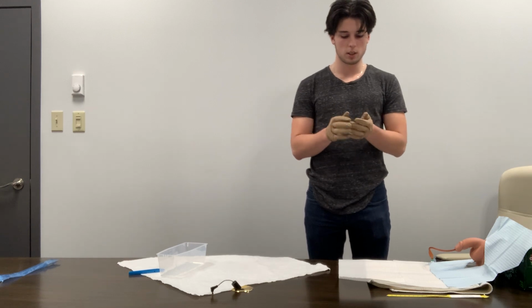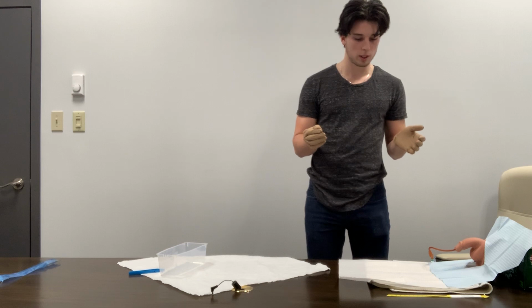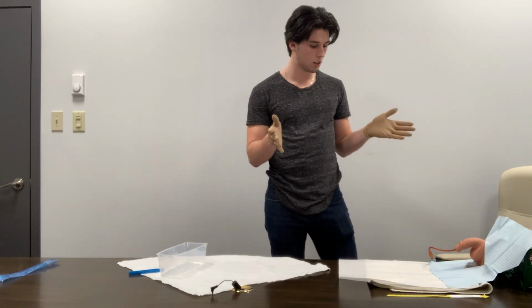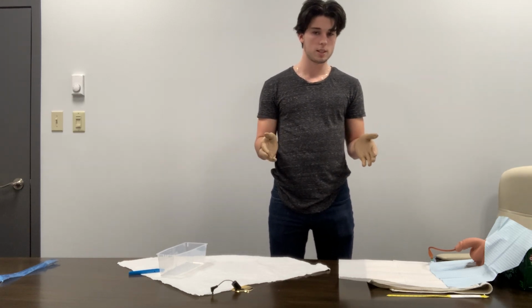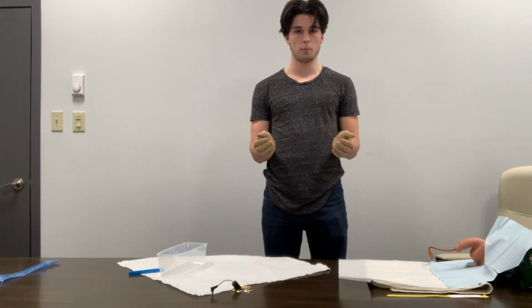We're going to wash our hands. We're going to take off our gloves. We're going to wash our hands, and then we are going to do a quick exit safety check. We're going to look around, make sure there's no concerns. I'm going to lower the bed again down to a safe level. Make sure they're safe and comfortable with the call light in place. And then after that, I'm going to finish and go document.